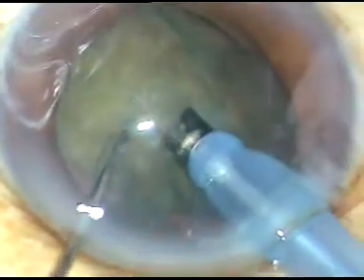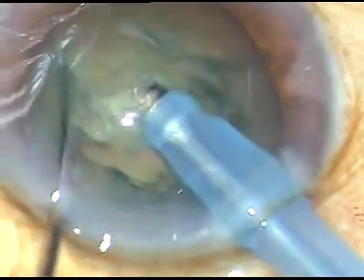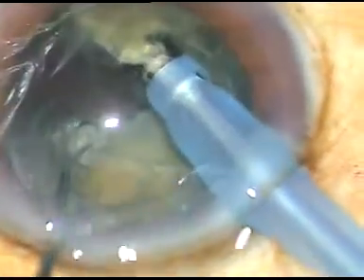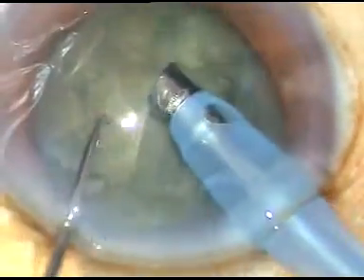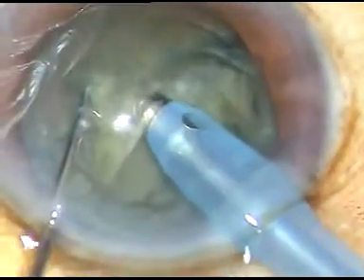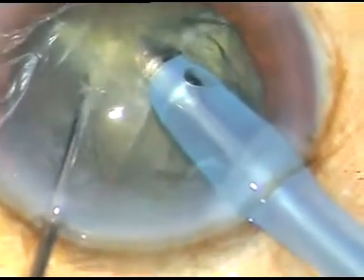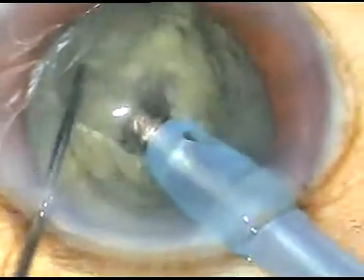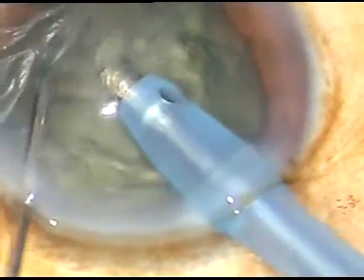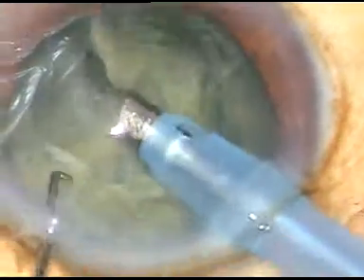Sculpt a little bit to go at a deeper plane, advance forward, and then chop the nucleus with a chopper. This is a very small chopper. It is called a micro chopper. This is another chop. So the nucleus has been divided into several parts.